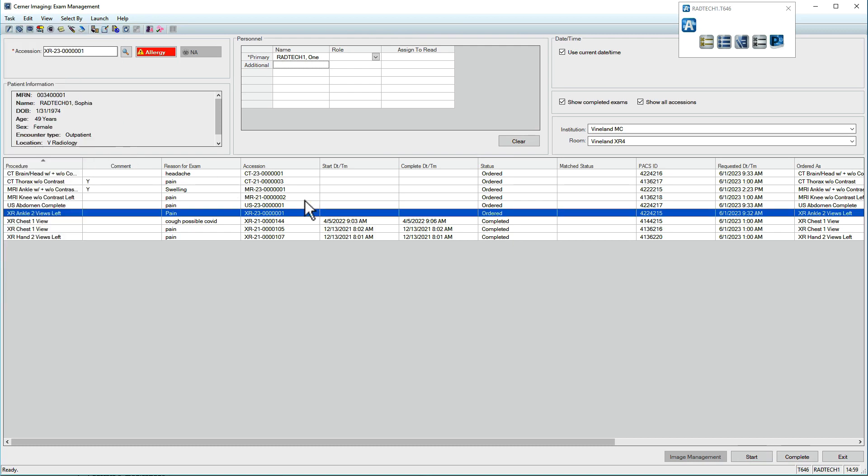When ready, you can start the exam again. Conduct the exam. When finished, click Complete.